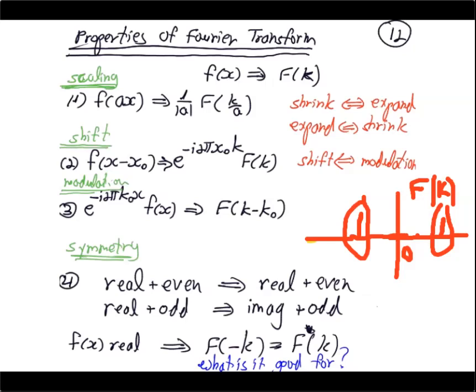And so in that case, the frequency domain has to have some redundancy that represents that lower dimensional space, and that symmetry really represents that. Okay, so you really only need to know half of the Fourier transform in order to complete the other one. And this actually has a lot of implication for MRI. And the first implication for MRI is what's called half Fourier imaging.